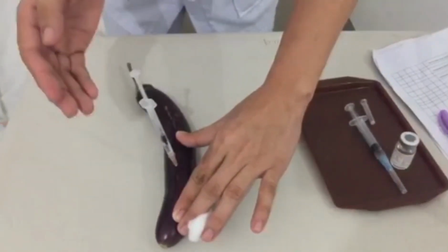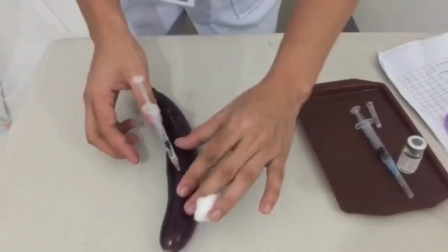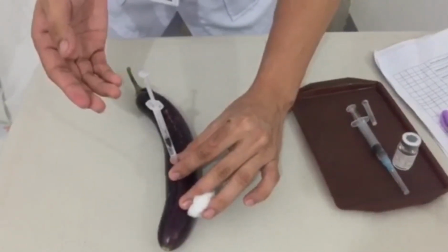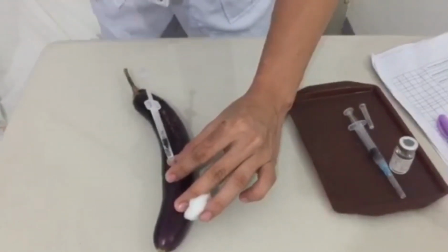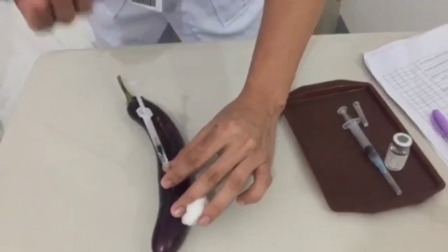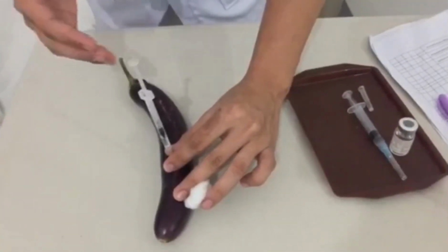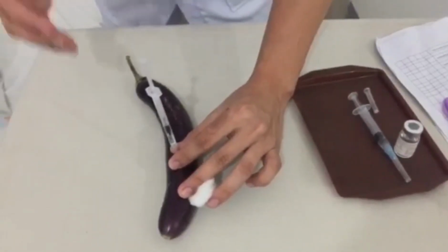When the needle is inserted, move your non-dominant hand to the end of the plunger. Some nurses find it easier to move the non-dominant hand to the barrel of the syringe and the dominant hand to the end of the plunger. And then inject the medication by holding the syringe steady and depressing the plunger with a slow, even pressure.